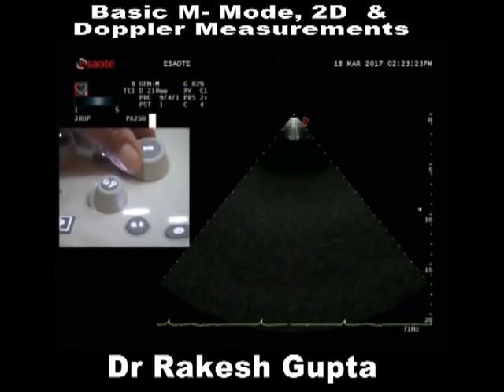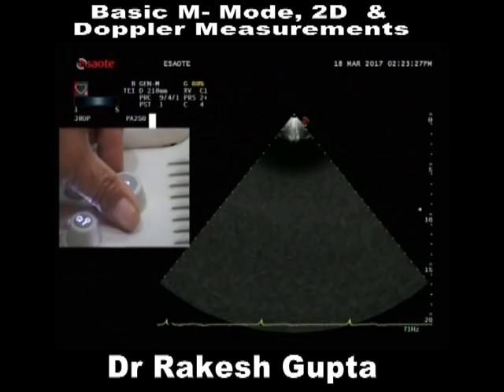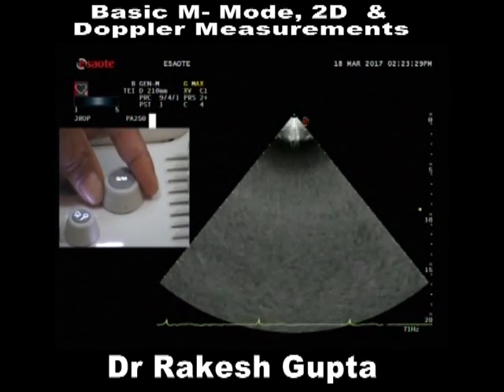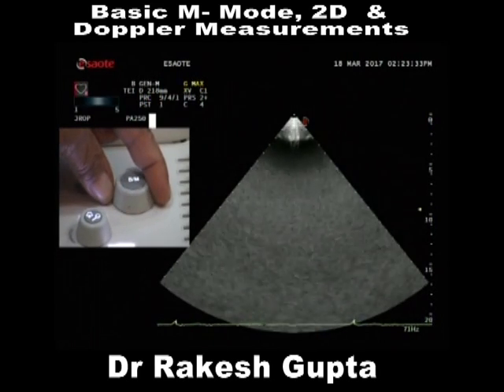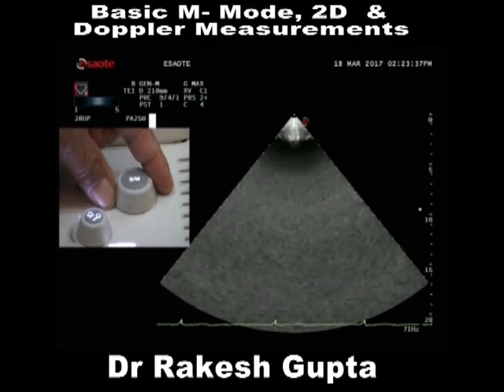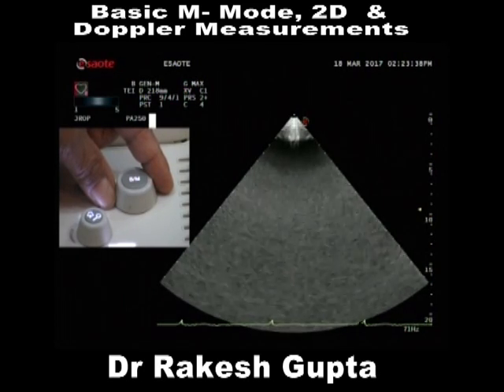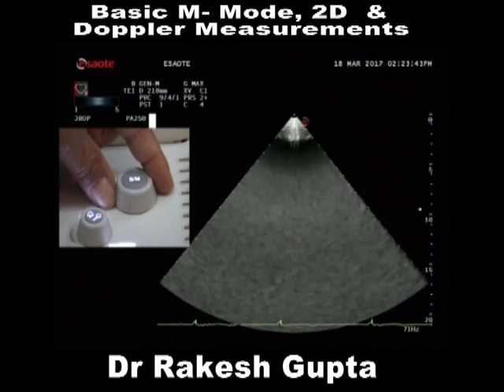Second, look at this knob, it shows B. I want to increase the gains. Is it the generalized gains I have increased? My gains were less, so I have increased my gains. Most important thing, look over here: these gains are good, but these gains are not good. So I move to this side and focus here.